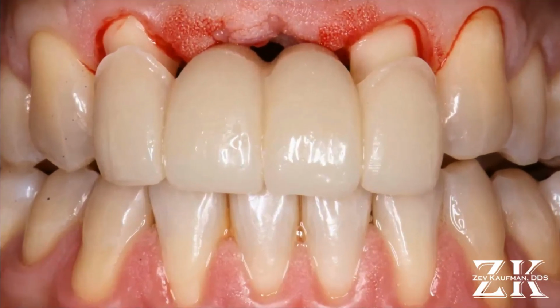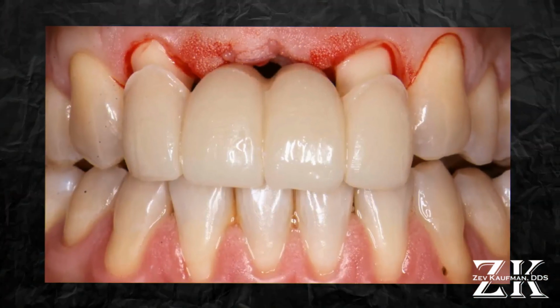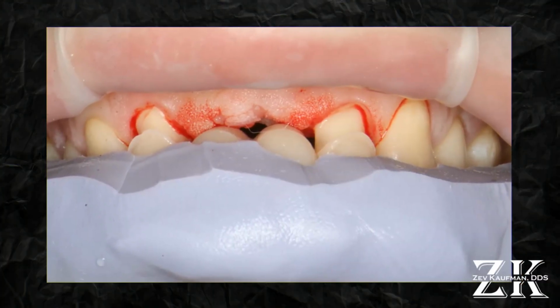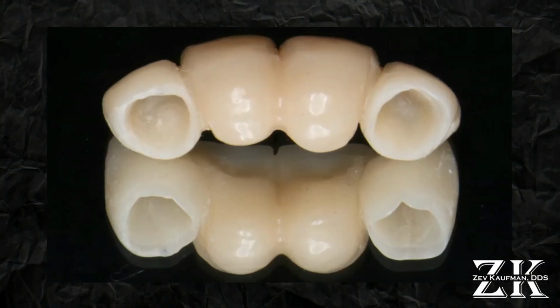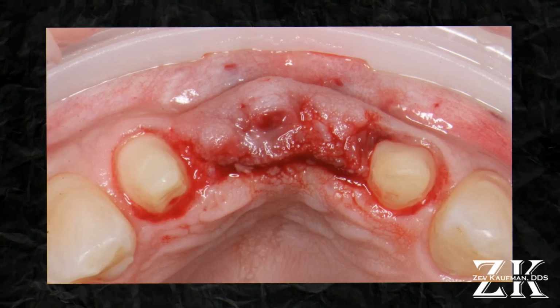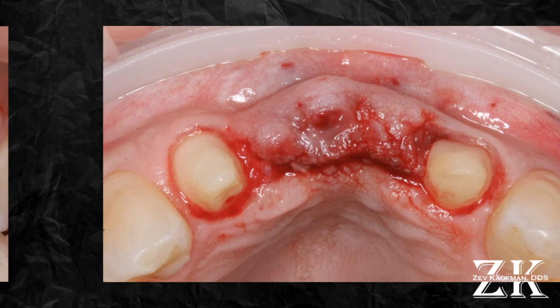Take a look here. These are the pontics. They're rounded, but they won't fit the tissue. So what do we do? We use a special silicone mold that allows me to position the bridge into the right place. And you can see here what it looks like underneath. And then we go ahead and open up the tissue. I make 1 incision closer to the palate and push all this tissue outwards, just like that.